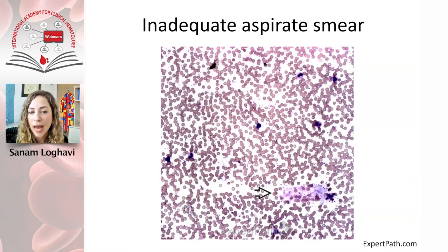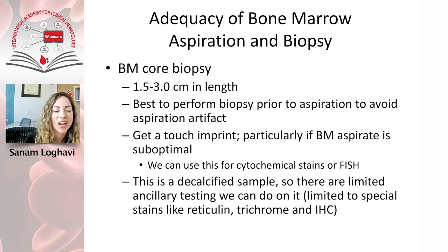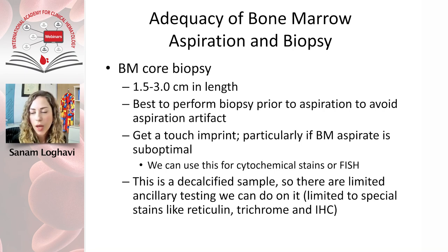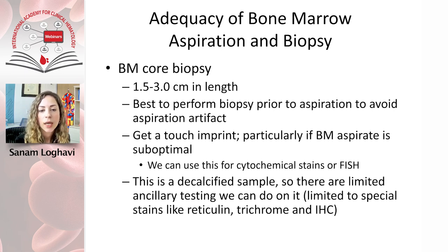On the other hand, this is an inadequate aspirate smear — it almost looks like peripheral blood, with only a few nucleated red blood cells, a few white cells, and no true spicules. For the core biopsy, ideally you want three centimeters in length, but practically we're happy with about 1.5 centimeters. It's best to perform the biopsy prior to the aspirate to avoid aspiration artifact. The core biopsy is great for getting a touch imprint, particularly if you have a dry tap, and that imprint can be used for cytochemical stains or FISH.